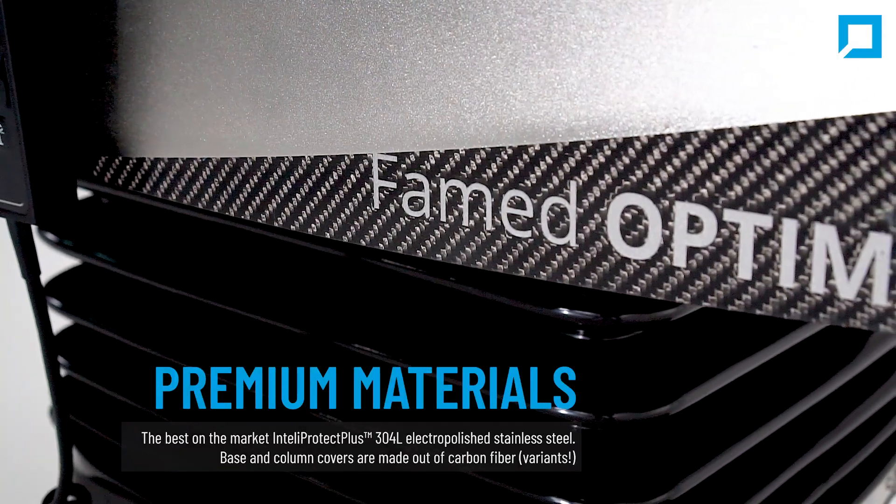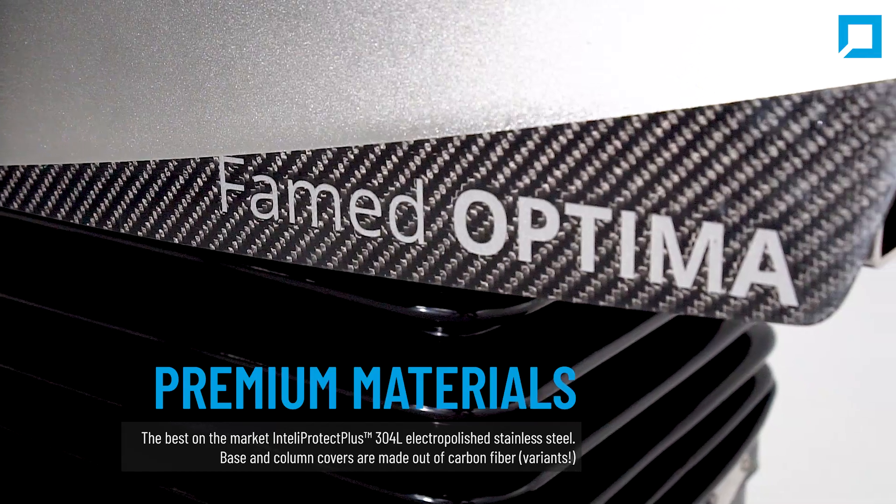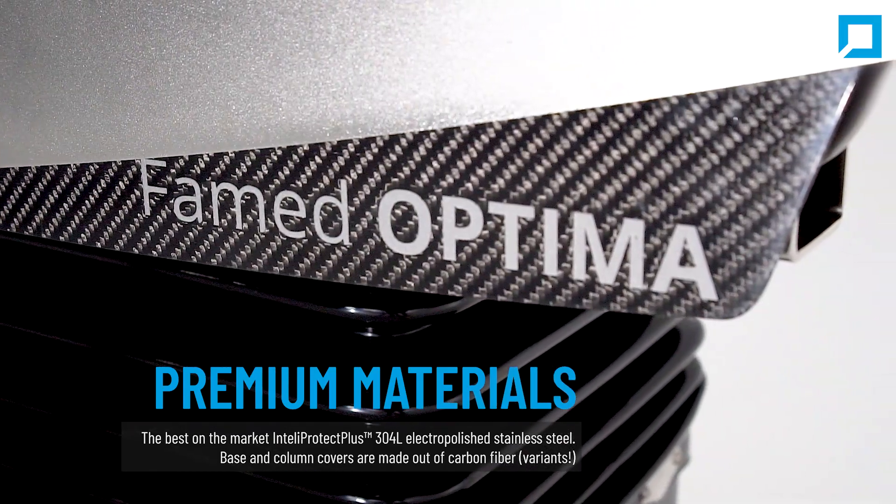Manufactured with premium materials like Intelliprotect Plus stainless steel. The base and column covers are made of carbon fiber or steel.